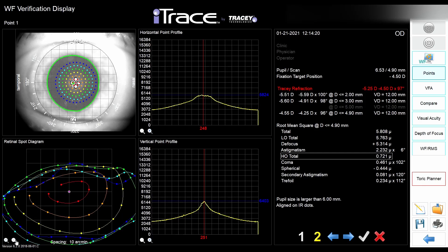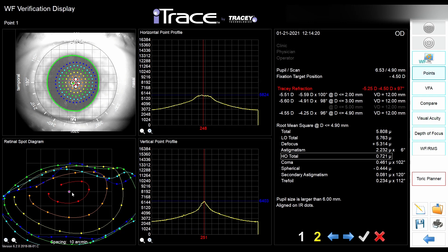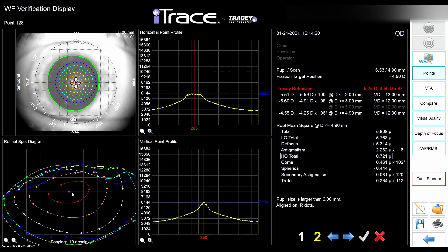After you successfully acquire an examination, you can review it in the verification window — you can discard it or accept it. This machine uses ray tracing technology, which is different from Hartmann-Shack sensors or dynamic skiascopy used in other aberometers. Here, 256 points scan the eye, falling on the retina, and the machine can see where those points are located.